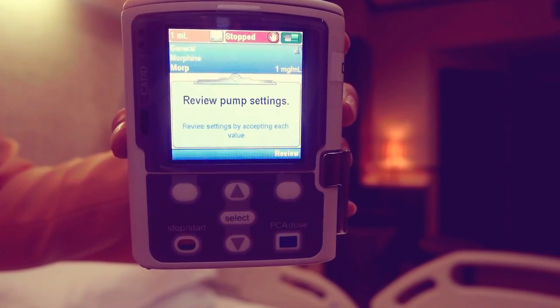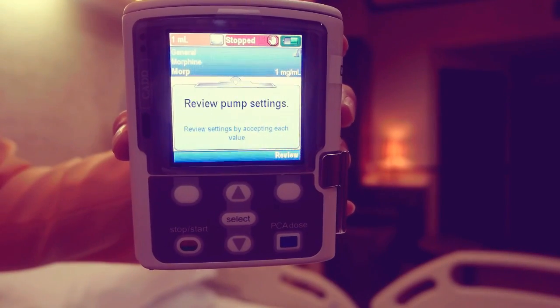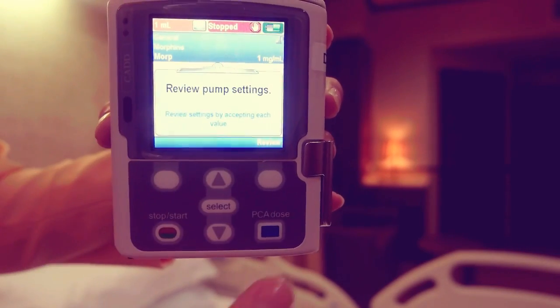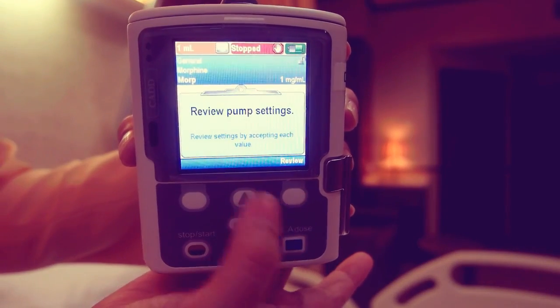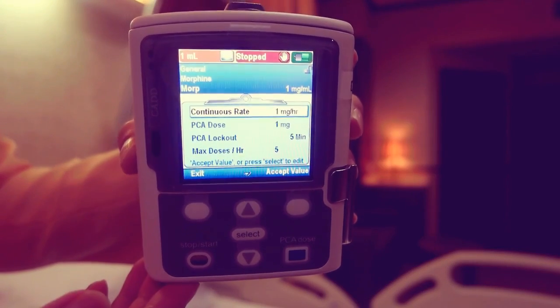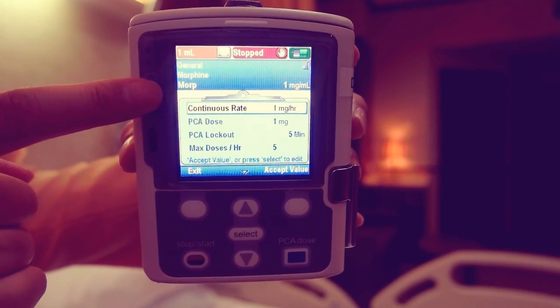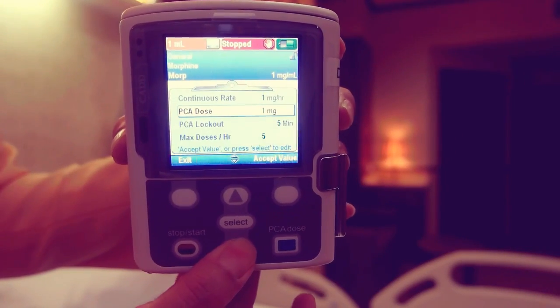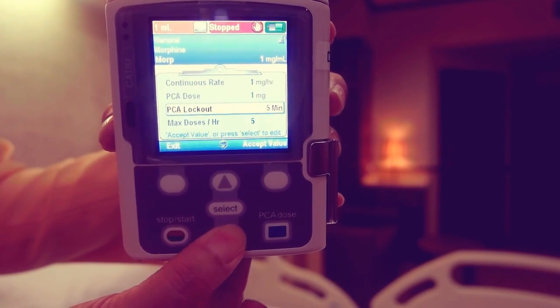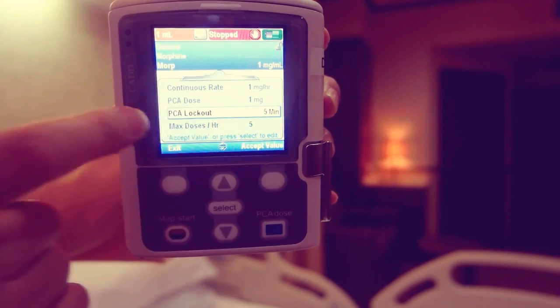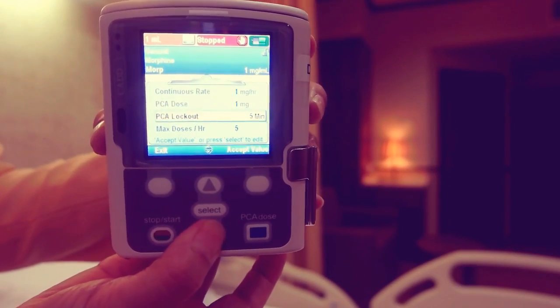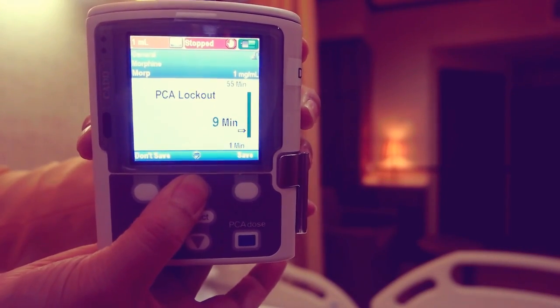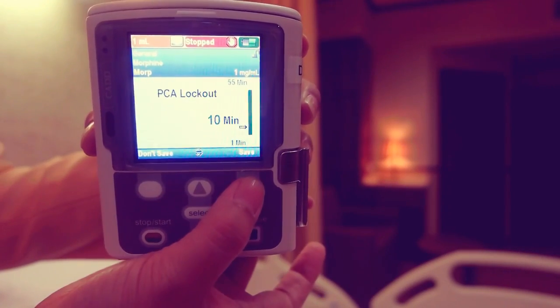Review pump settings displays. Press review. To edit or change a patient specific parameter, highlight it and press select. Scroll up and down to the new value then press save.